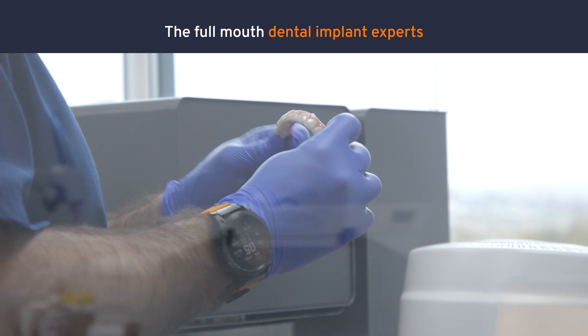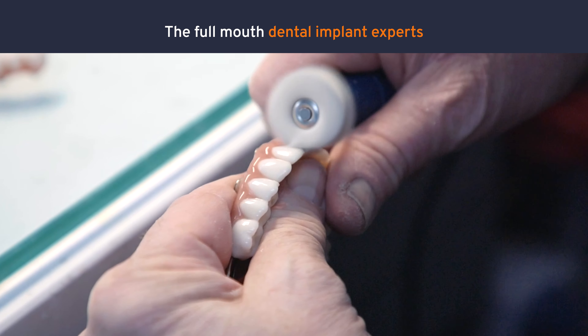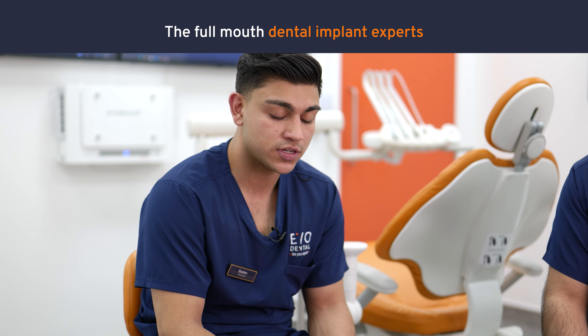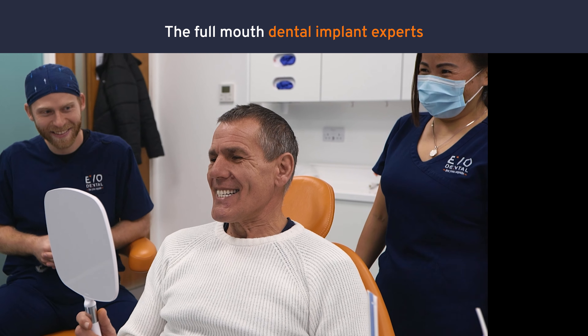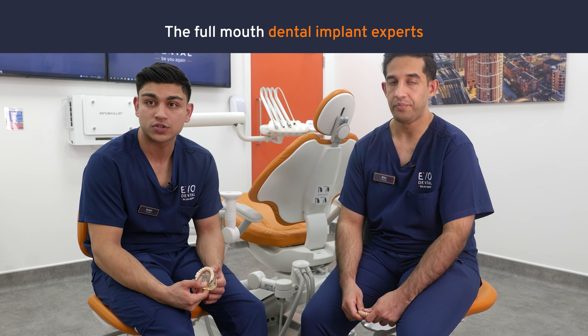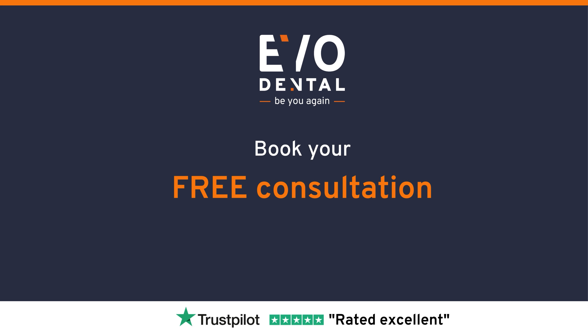The Ultimate is made out of a ceramic material called zirconia. We're able to colour the gums and make them a lot more natural looking and blend in with the patient's own anatomy. The zirconia is incredibly hard wearing. The amount of wear and tear a patient could expect with an Ultimate bridge is going to be far lower, and as a consequence it's going to look very similar at year five or year ten to how it looked at year one.